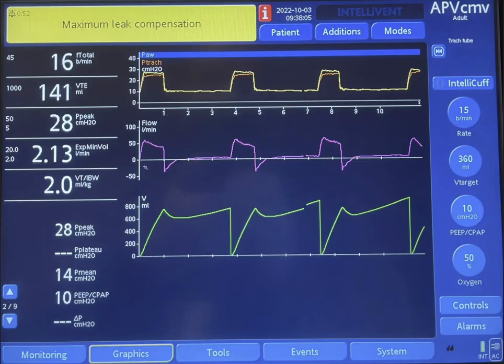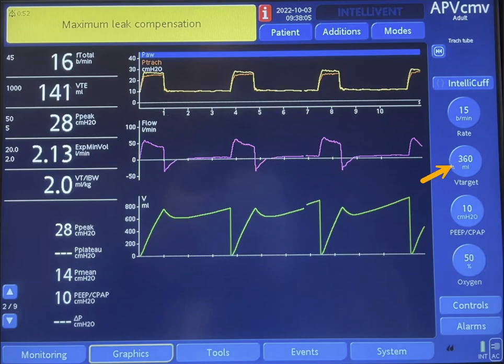With inspiration, the flow goes up to the maximum inspiratory flow. With that, you can see the tidal volume starts to rise and reaches around 700 to 800 ml. However, we're targeting 360, so the machine ends up giving a larger tidal volume than the targeted volume.